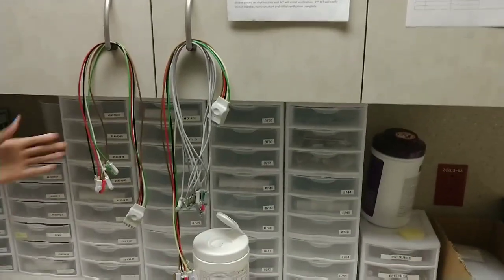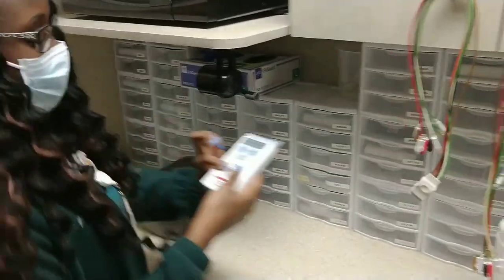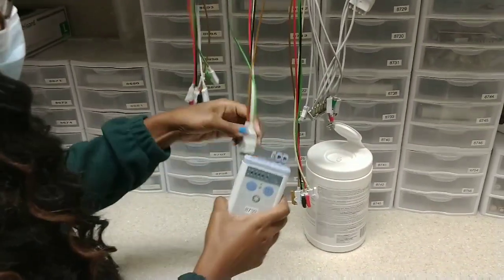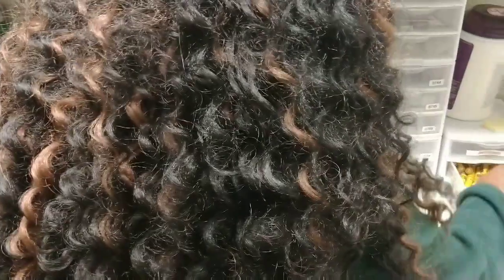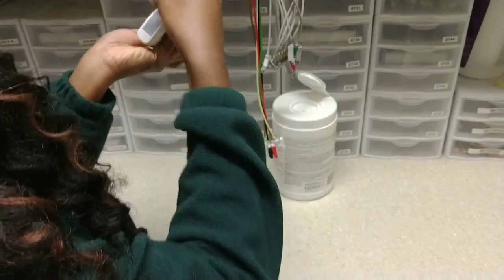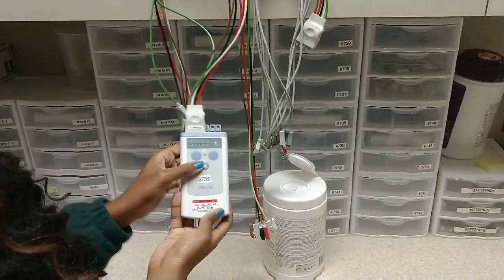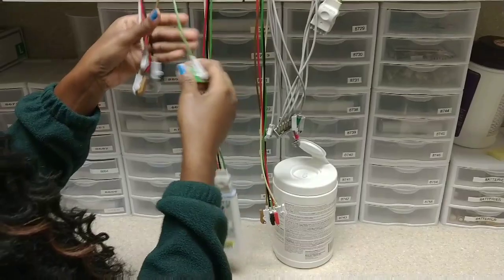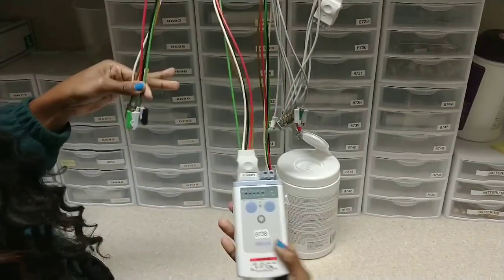Okay, so these are tele leads, and this is a tele box. So basically, we put these in here, put some battery in. Okay, so it's on, and then these go on the patients, and then we put them in the system, and then they'll show up with a rhythm.